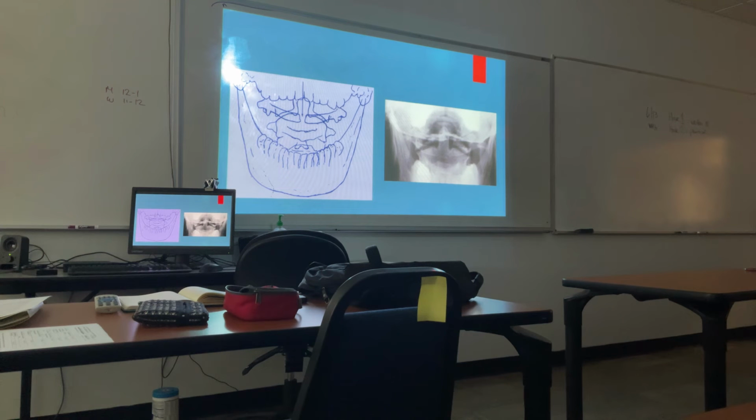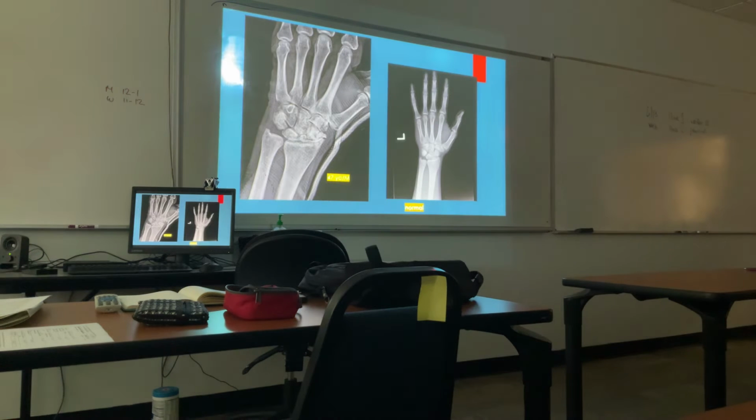Okay, now they bring it to you because my son has suboccipital headaches. But yeah, if he's practicing football and hyperextending with trauma, okay, he doesn't have the posterior neural arch that everybody else does, so he's an at-risk patient. Okay, these little blips are just what I just said, little blips. Okay.